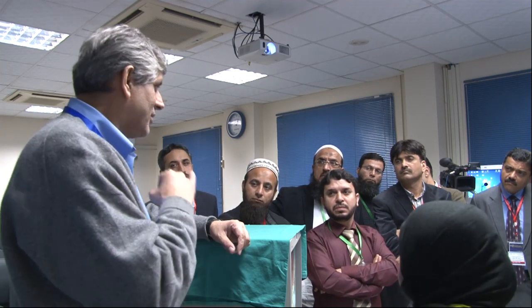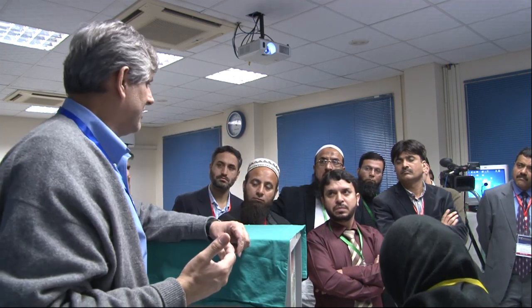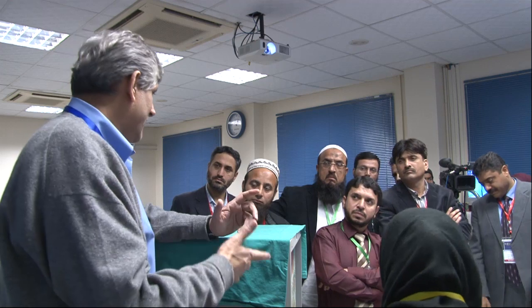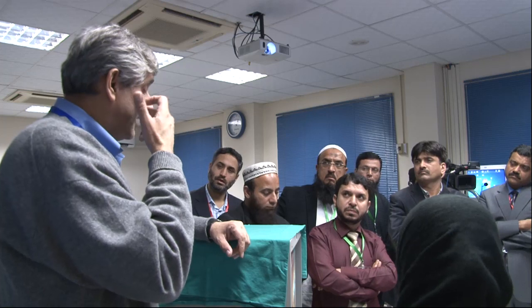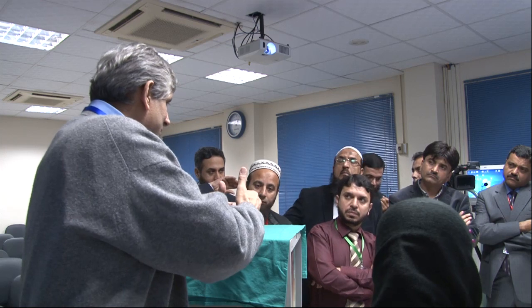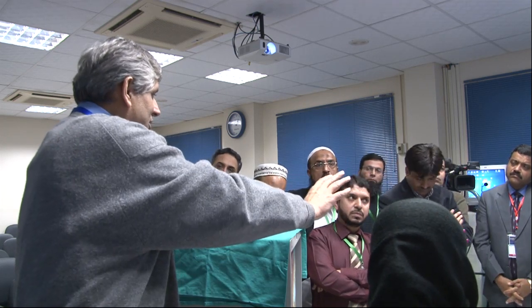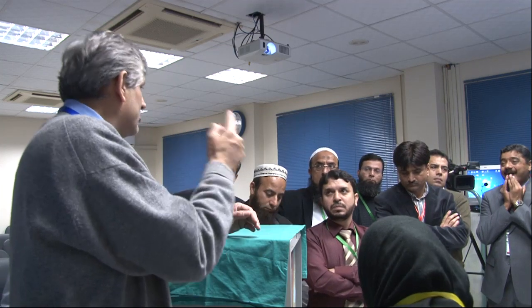Whether it's colonoscopy or whatever you're doing, you should not fear that you've reached a place once, you will go back again. And ERCP scope reduction is very, very simple. It should be done slowly, doesn't have to be done too fast, gently, and the movements are very simple, as Prakash just explained. So try and improve on everything. Are you getting straight into the sunset sign? Are you passing into the pylorus, reaching the pylorus? Is the patient very uncomfortable? Are you taking too much time, putting in too much air? All those things you need to work on.